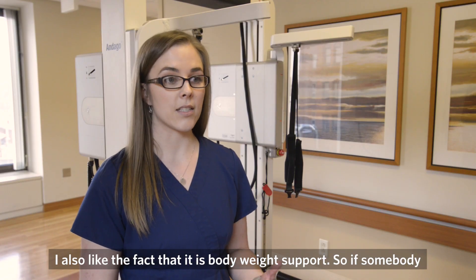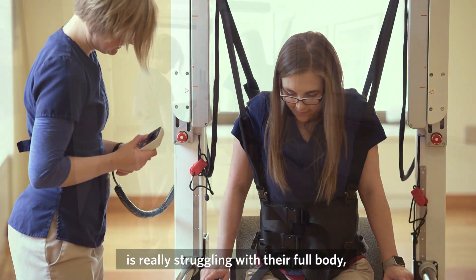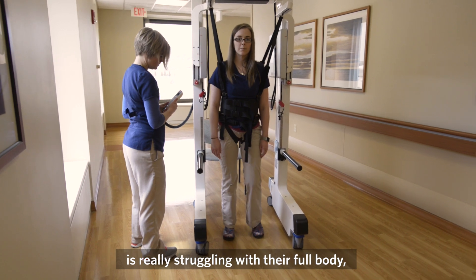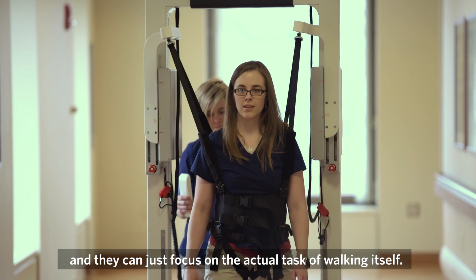I also like the fact that it is body weight support. So if somebody is really struggling with their full body weight, they can take some pressure off and they can just focus on the actual task of walking itself.